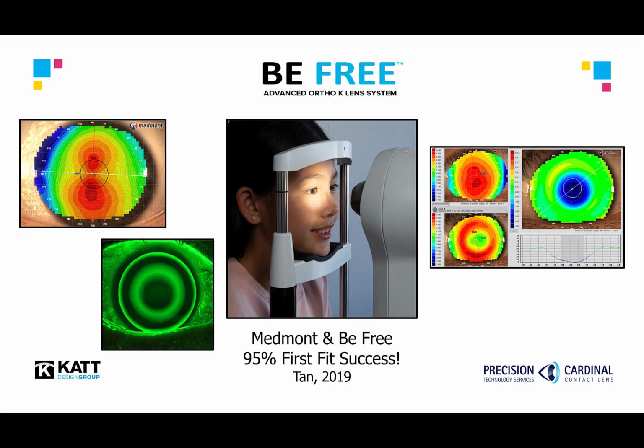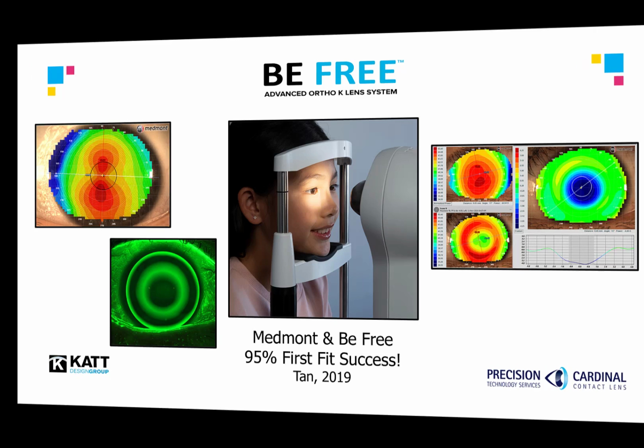The preferred instrument of the BE FREE Advanced Ortho Keratology lens system is the Medmont, and that's because its accuracy is so high. In a study at Hong Kong Polytechnic University by Tan and colleagues, they found the Medmont and BE FREE together had a 95% first fit success rate. Medmont users can be very confident with their fitting using the Medmont and the BE FREE system together.